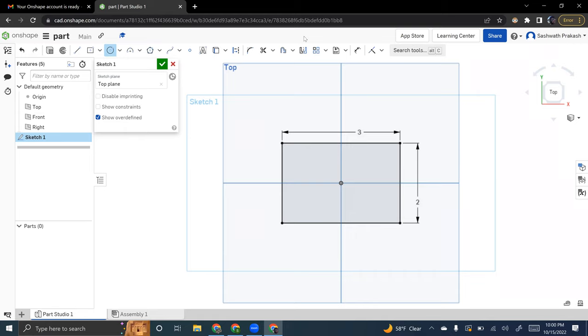So what you're going to do is go to sketch. Oh, you already made a sketch. Okay. For the person on Zoom, we're using inches and pounds. You want to see this whenever you're making a sketch. It's the default. Now you can go to top view, and you can move it around as needed.